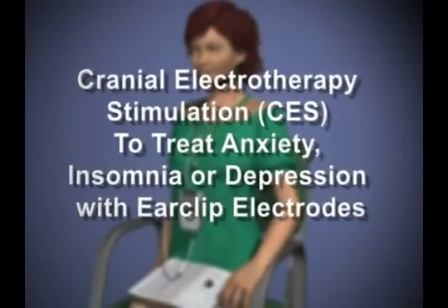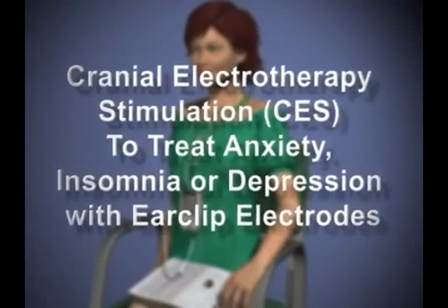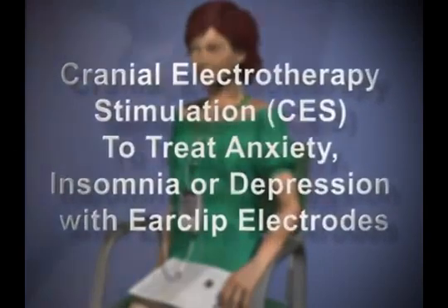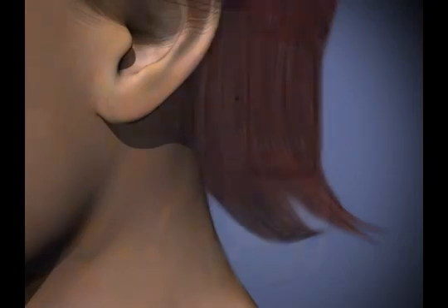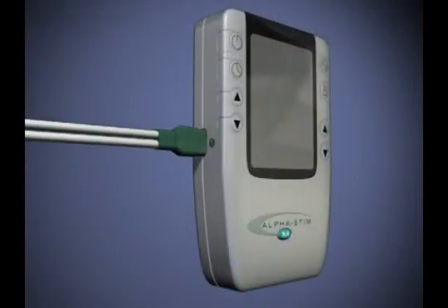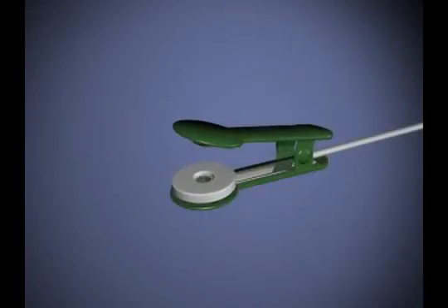Cranial electrotherapy stimulation to treat anxiety, insomnia, or depression with ear clip electrodes. Clean skin of earlobes with mild soap and water or alcohol wipes and allow them to dry. Plug dual connector end of ear clip wires into channel 1 or channel 2 jack. Remove old ear clip electrode pads if present. Attach 4 new ear clip electrode pads.